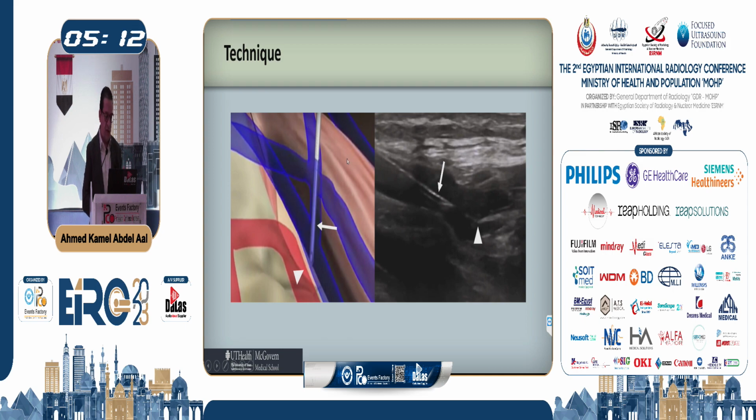I'm going to just show you a diagram and the ultrasound accompanying picture with it. So you have to access the perforator, and then through the perforator you access the radial artery. Again, one of the disadvantages here of this device is that you can only use it for the radial side. It doesn't apply to the ulnar side. So if the anatomy is not favorable on the radial side, then you have lost these patients. In other words, the qualification of patients for this device is slightly less than the WavelinQ.